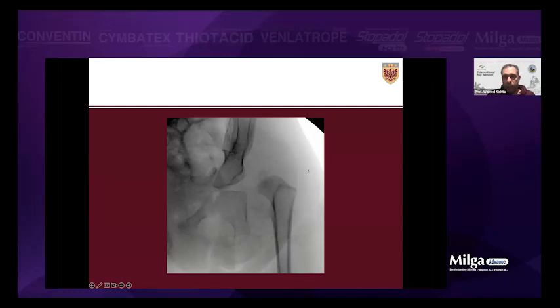So after I split the apophysis, now I go all the way down. Make sure when you go down, you still see the anterior superior iliac spine, and I go with the Cobb or periosteal elevator, whatever you have. I prefer the Cobb. So go subperiosteal until you get to the sciatic notch, the greater sciatic notch.